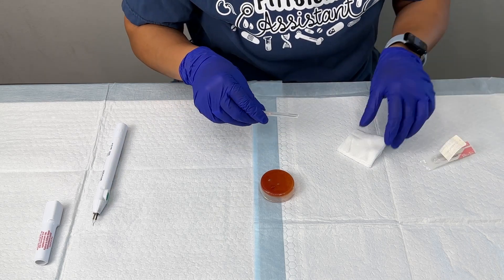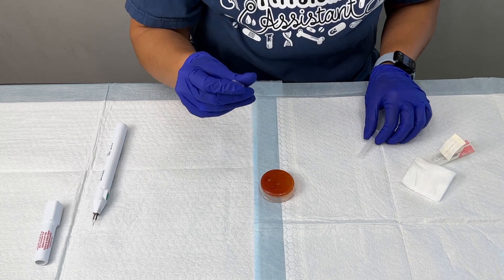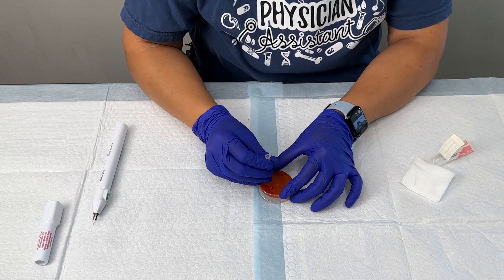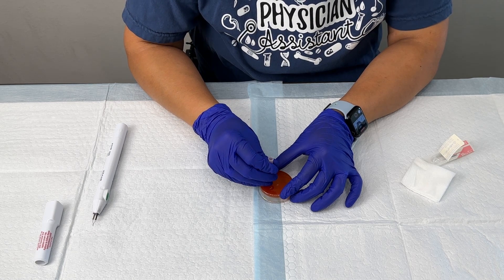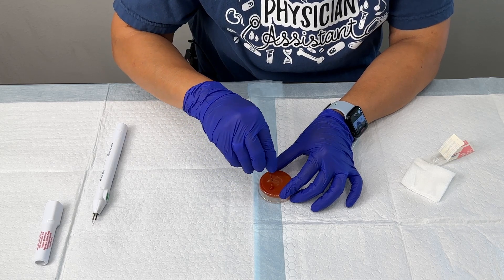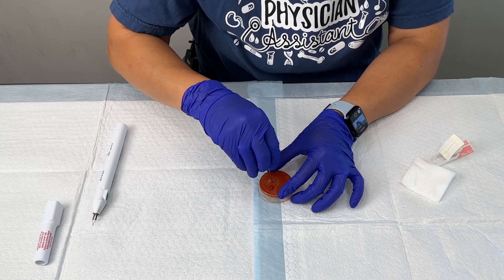I've already prepped the nail with any solution I'm going to be using. I'll take my 18 gauge needle, and basically what I'm going to do is go back and forth in a circular pattern — this will gently bore a hole in the nail. You want to do it gently, just keep going back and forth gently until you feel a little bit of a give and you see some of that blood start coming out. There — I'm through.